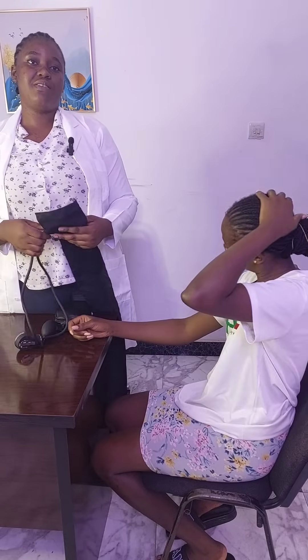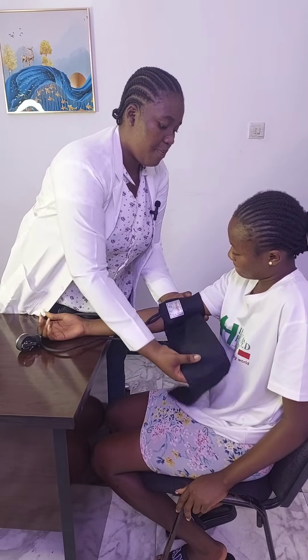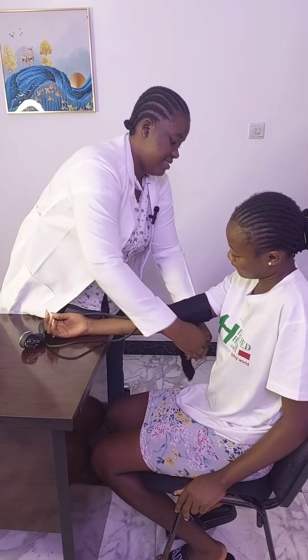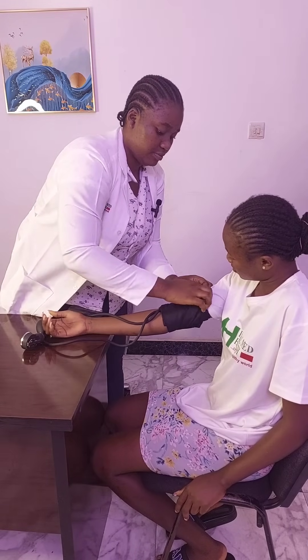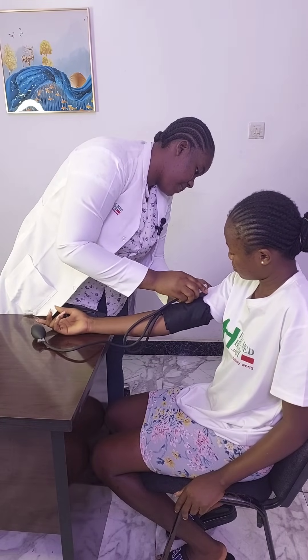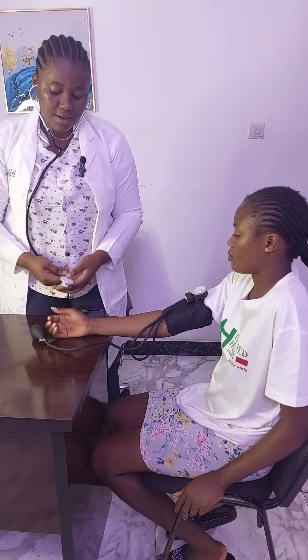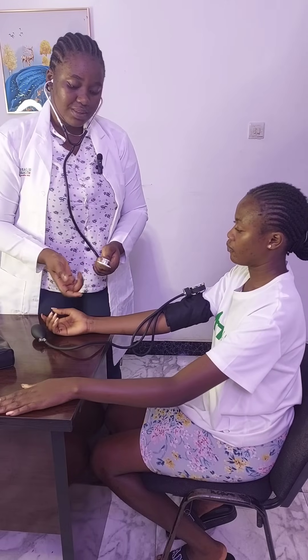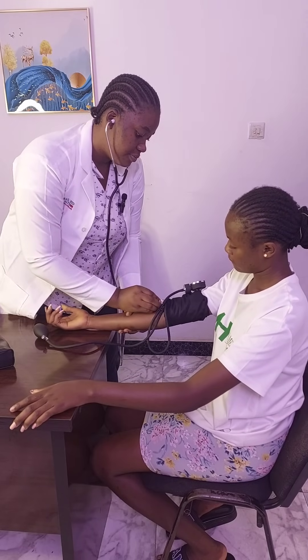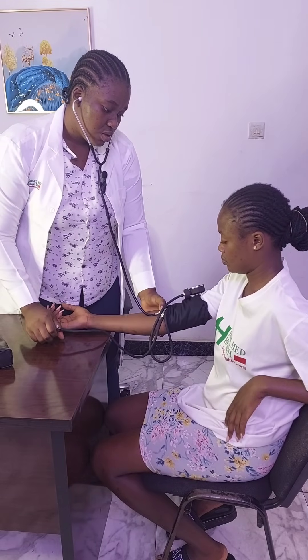Firstly, I place the cuff on her upper arm. You place your manometer and secure it. Then place your stethoscope on the brachial artery, which is the artery at the upper arm.